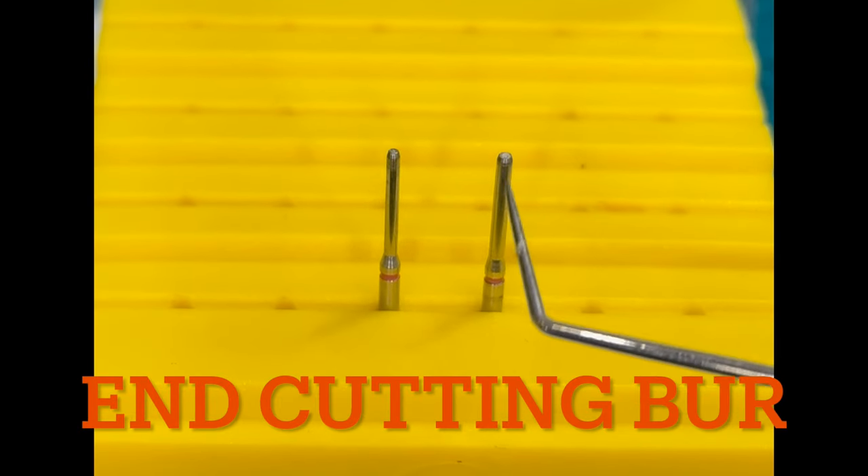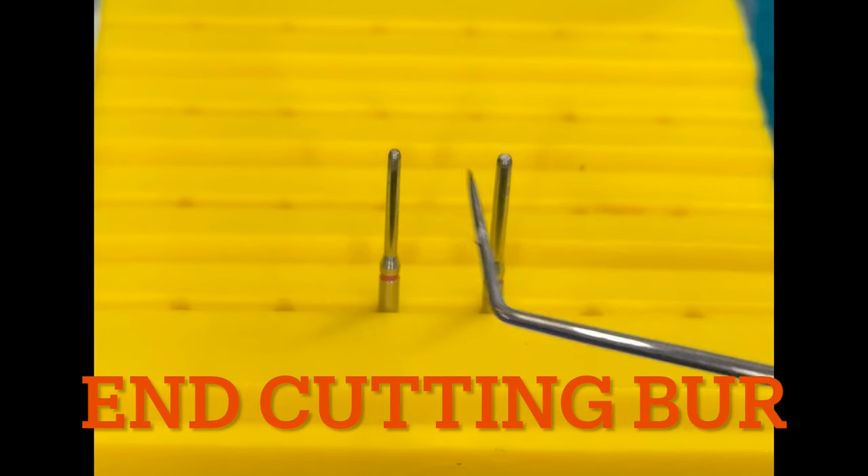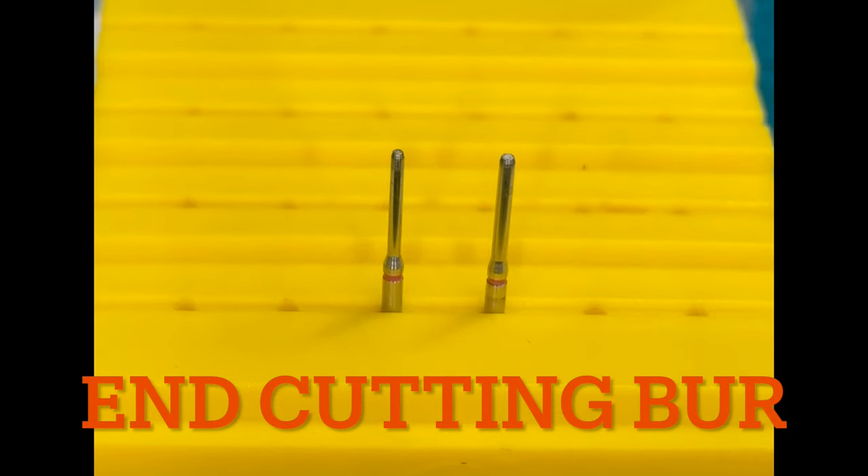These are end cutting burs. The sides are blank and the cutting diamond is present only at the edges, as you can see here. These are basically used for finishing the margins after they have been prepared.